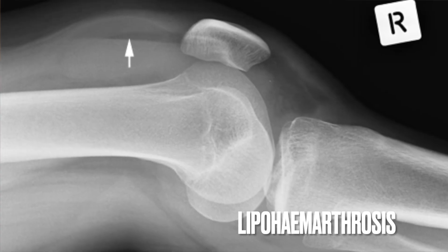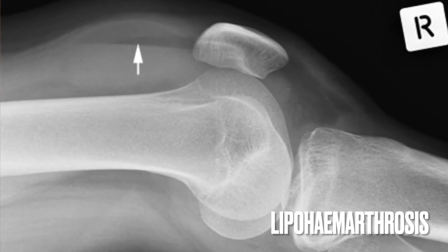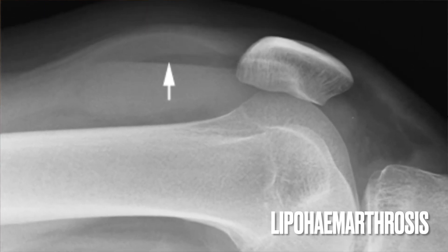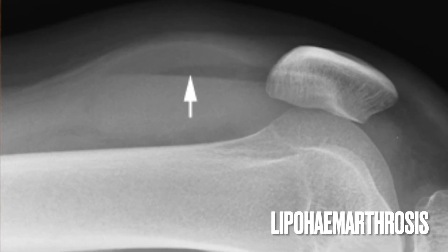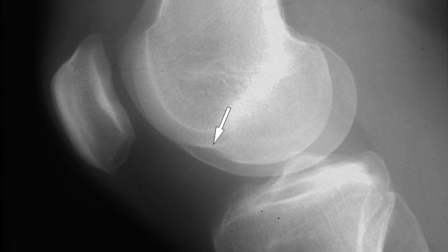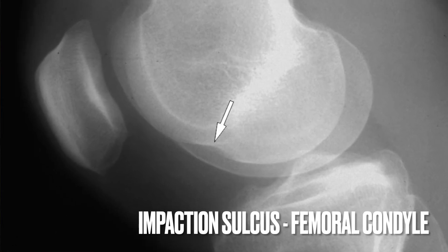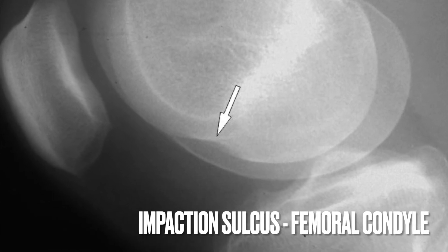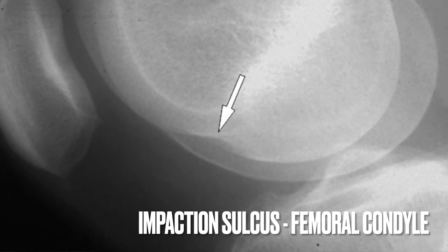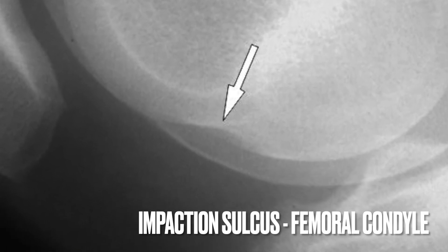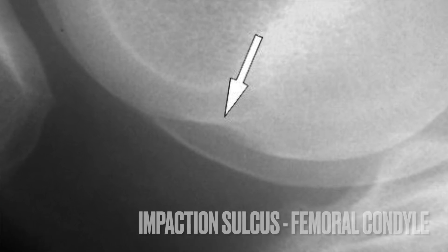On the lateral view, this can demonstrate an effusion or lipohemarthrosis, which is fat and blood in the joint. The lateral view can also demonstrate an impaction sulcus in the lateral femoral condyle, and when that's present it is again very suggestive of an injury to the anterior cruciate ligament.